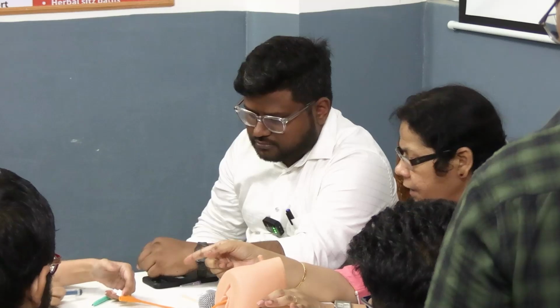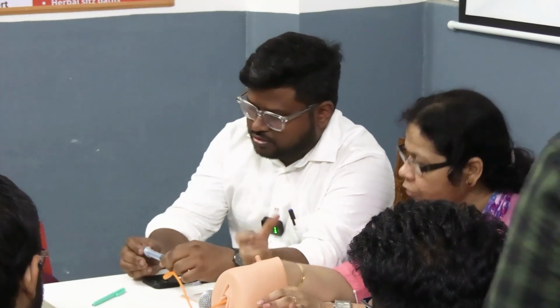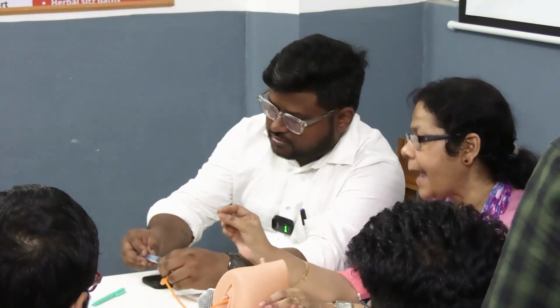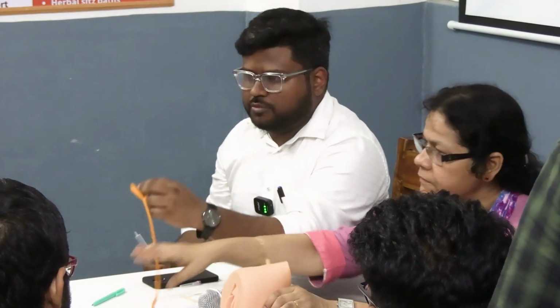If this is air, it may not come out fully, but if it is fluid, it will come out. It's going to take a little bit of time. You put it inside fully so that it takes out the valve. It has to be airtight there. If you have a gap, it will not work. See, it has come out. Now if you remove it, it comes out. This is removing a catheter. This is simple. But asepsis has to be taken before you do, and once again consent has to be taken before you do any procedure on the patient.